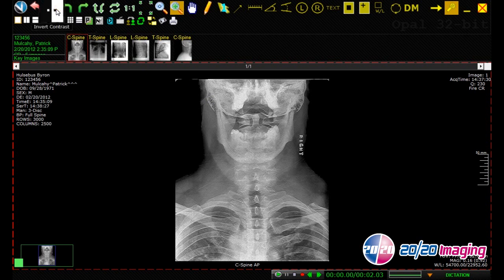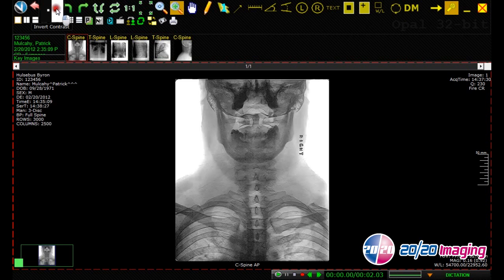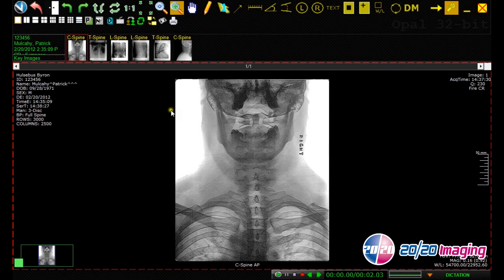The invert contrast tool allows us to view the image as a negative. This makes it easier to see a fine bone cortex fracture or to locate a soft tissue structure that may not be clearly visible in regular viewing mode.